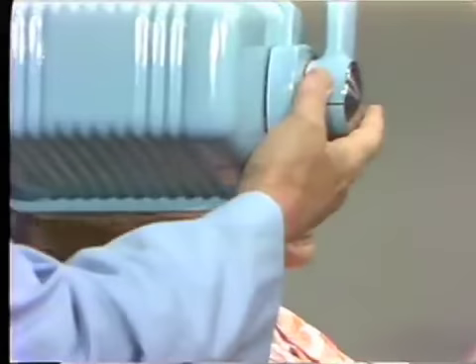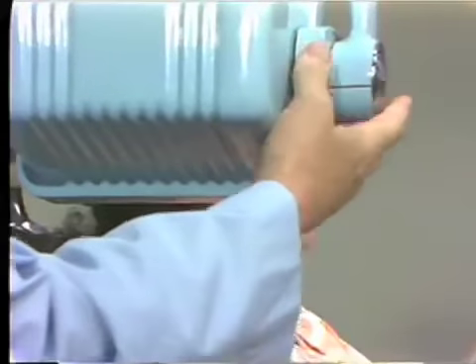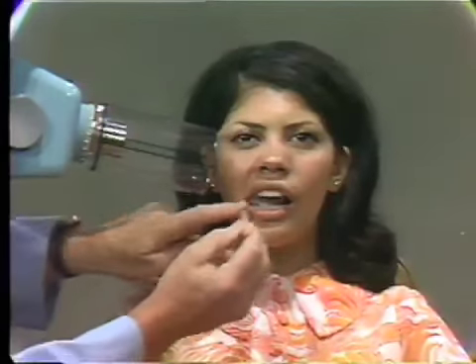Well, now, there isn't a whole lot that one can see from this view. So a view from the front of the patient would be indicated. And here we will endeavor to line up the buccal surfaces of her teeth as indicated by this stick, and the front of the cone indicated by this stick.